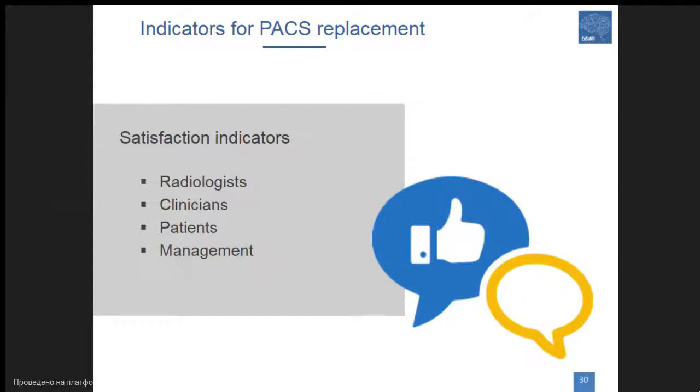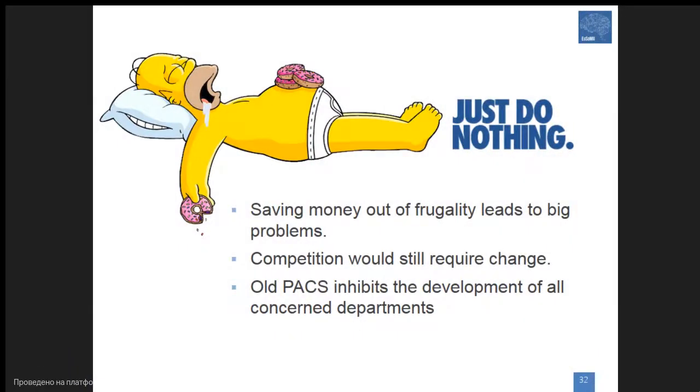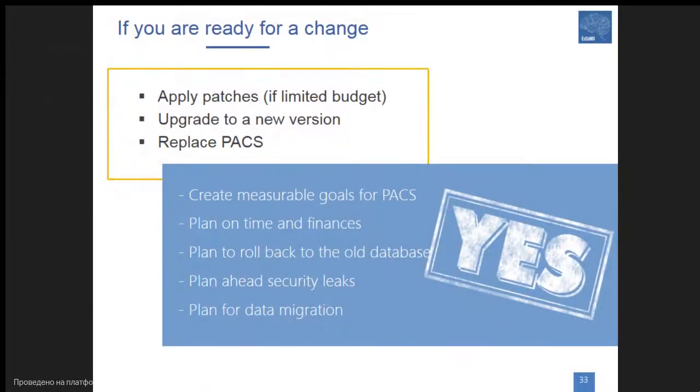So everybody should be happy, including the radiologists, clinicians, patients, and management of the hospital. By analyzing these indicators, you can get the answer: should we change the PACS? Then you can do just nothing and leave the system the way it exists. But saving money out of frugality leads to big problems, or even bigger problems. And competition would still require change, and an old PACS would inhibit the development of all departments.